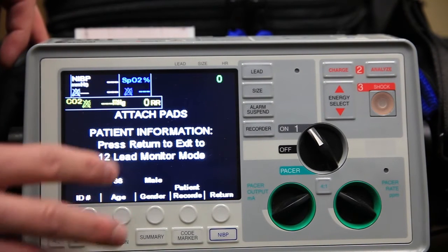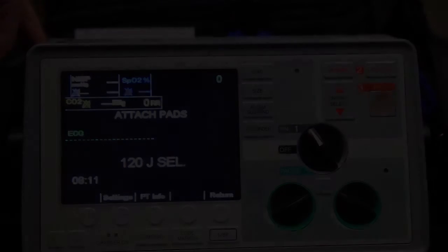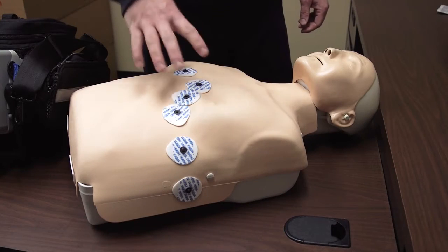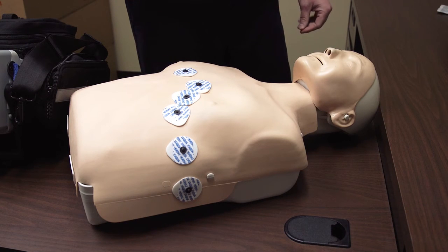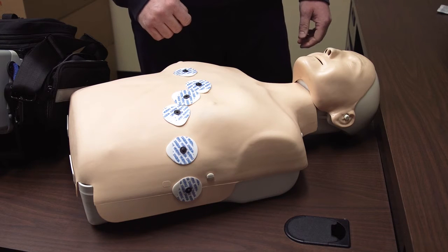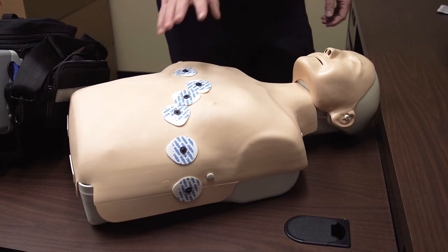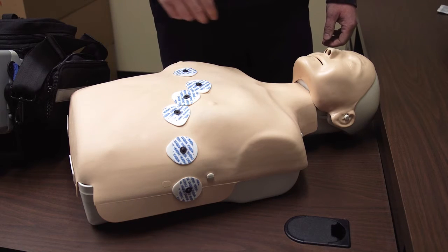Now we're ready to acquire the 12-lead. You need to landmark. Note that this mannequin is not proportional, but you need to know how to landmark the areas. There are six leads. We have a reference card in the side pouch of the cardiac monitor.